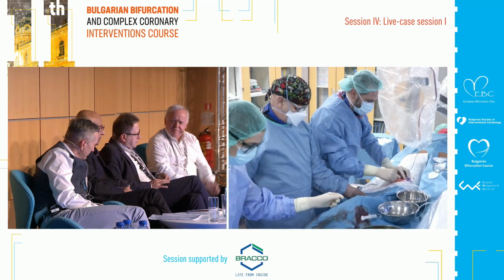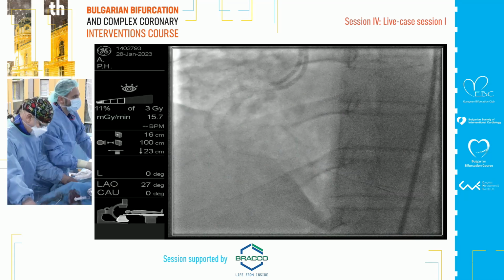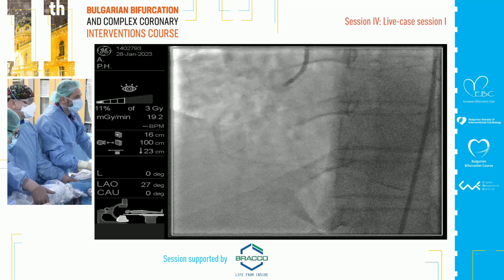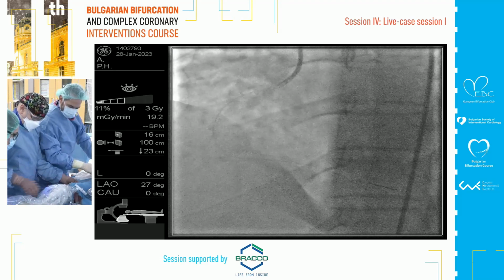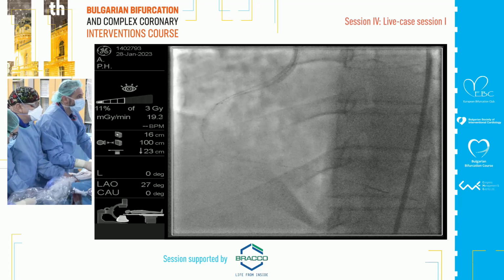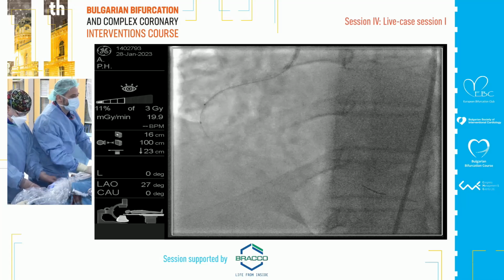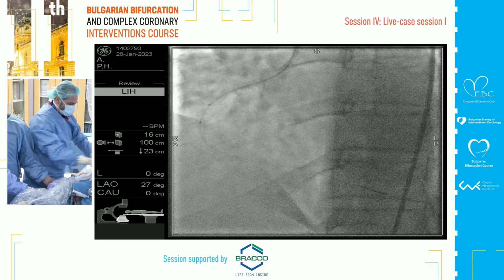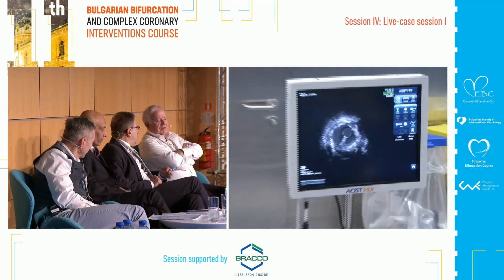May I ask you, if you have the case when you didn't cover the ostium, let's say, just 1.5, less than 2 millimeters, and you have already implanted a stent, what do you prefer? Can we start to use an additional stent, or just wait for restenosis and drug-eluting balloon? What is your strategy? I'm not sure that drug-eluting balloon will work properly.